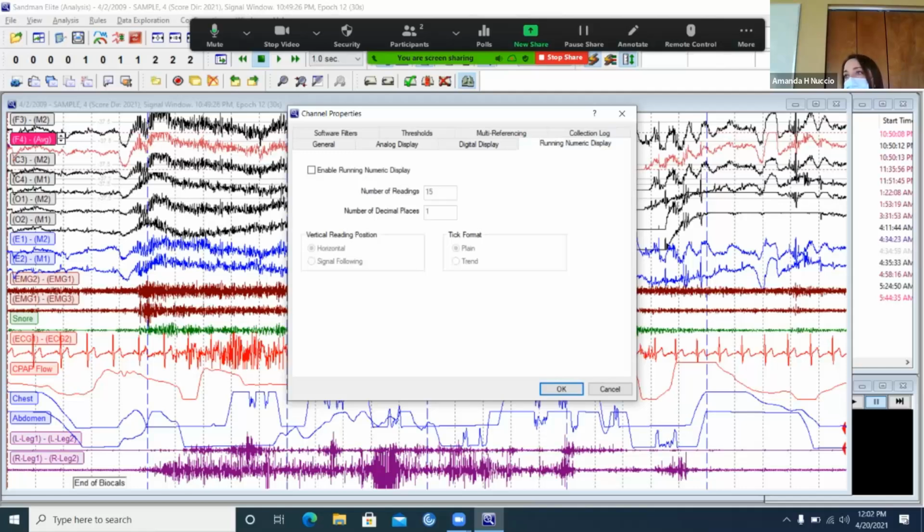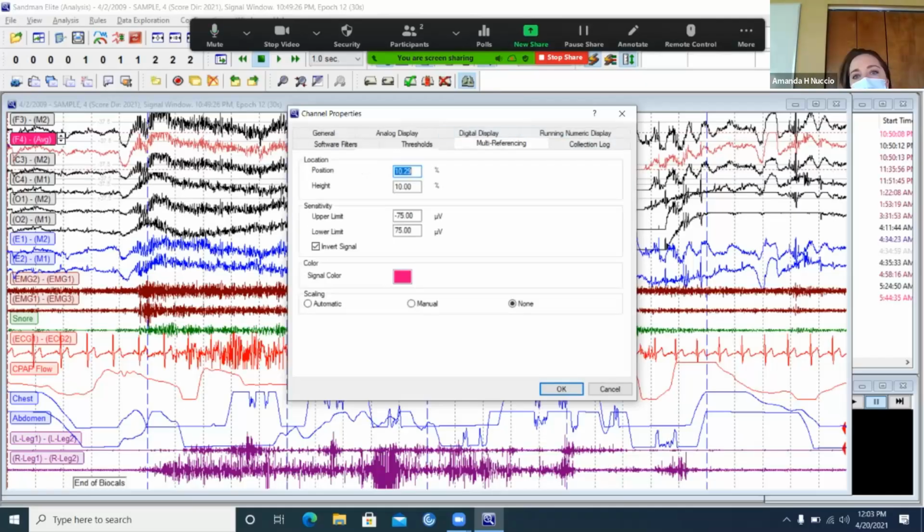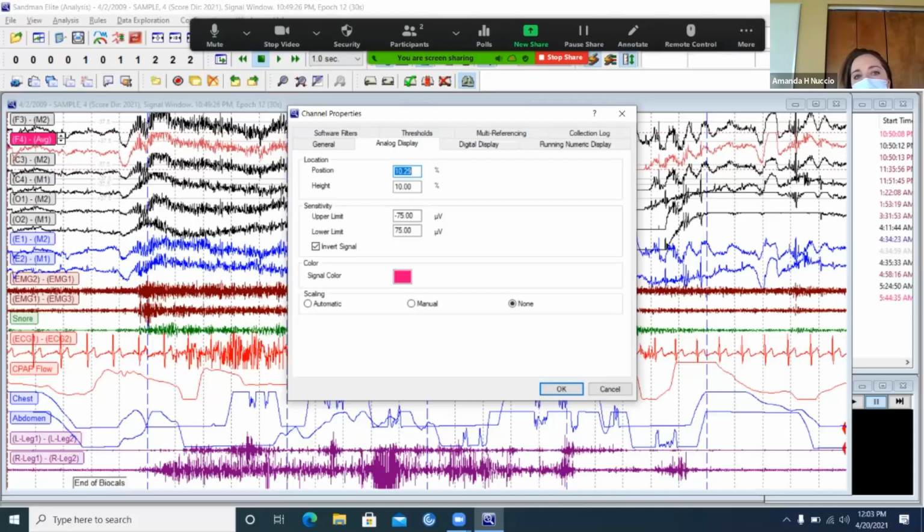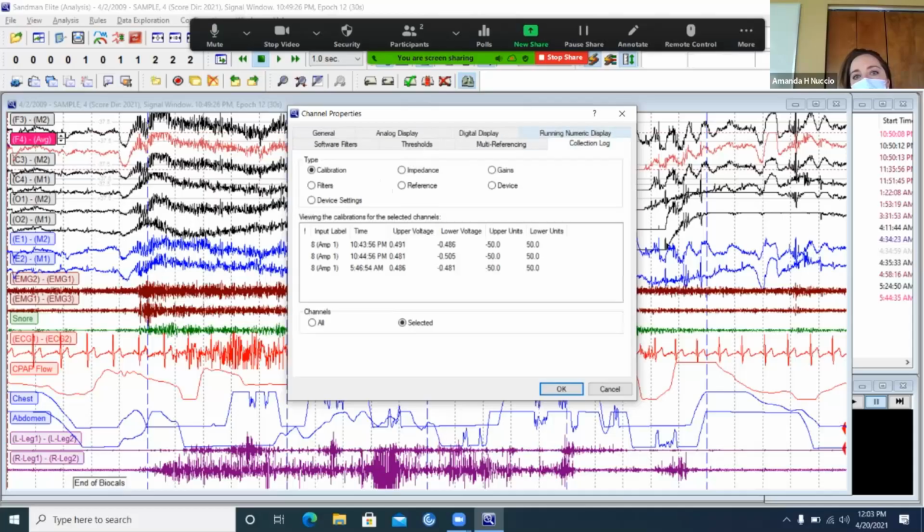Kind of the same way with our bed 2 and 3 computers, you can go individually, you just right click on them and you get the option to adjust your filters, your gain, all of that through those channels. Or there's a way to do it all at once where there's a montage button to pull it up, and I can show you guys that in lab this week. I think there's no way to actually change the gain sensitivity in these aside from increasing or decreasing the arrow, doing it that way.